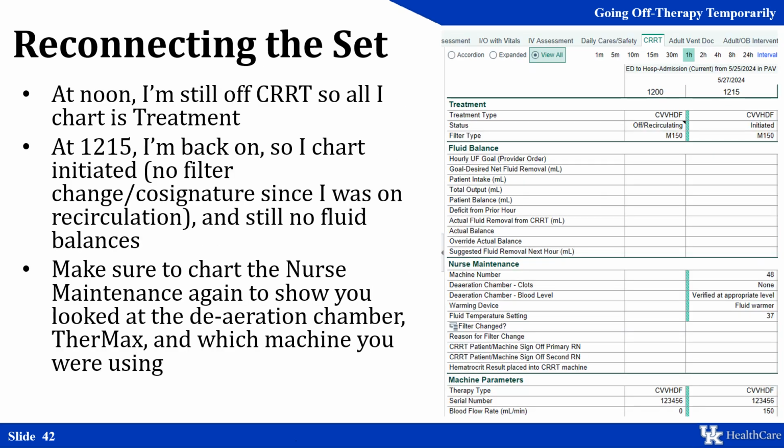At noon, your patient is still off and it's still recirculating, so that's going to be your status for noon. At 12:15, when you finally return, you'll go back to initiated or restarted, and then you'll go through your nurse maintenance and machine parameters. However, since we don't have the intake and output for noon documented, we'll leave the fluid balance blank.